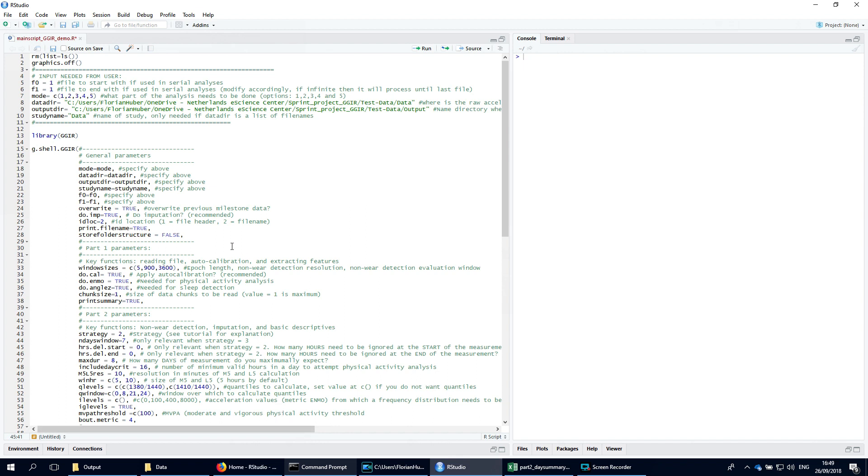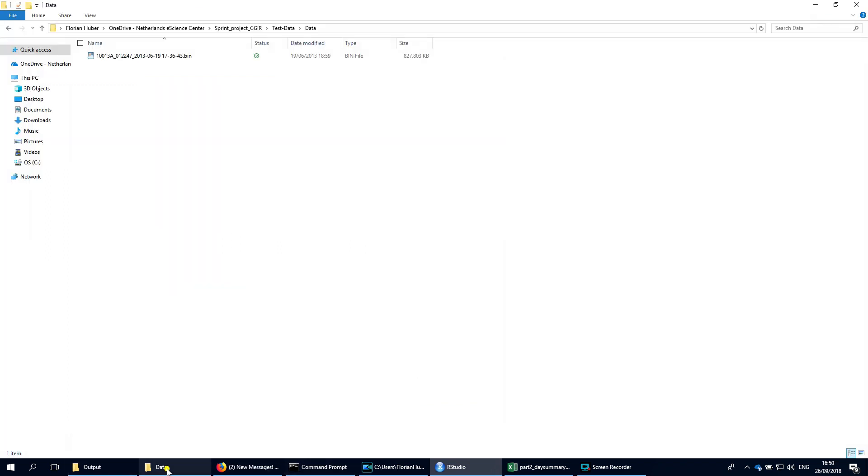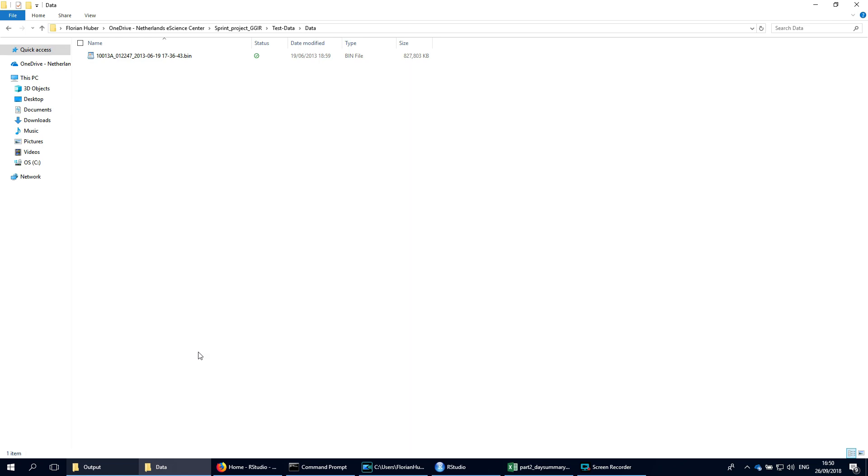Now we can start working on the accelerometer data. Copy the raw data files into the dedicated folder. The name of this folder will be used as study name in the reports that are generated by GGIR. In this case our folder name is simply data.